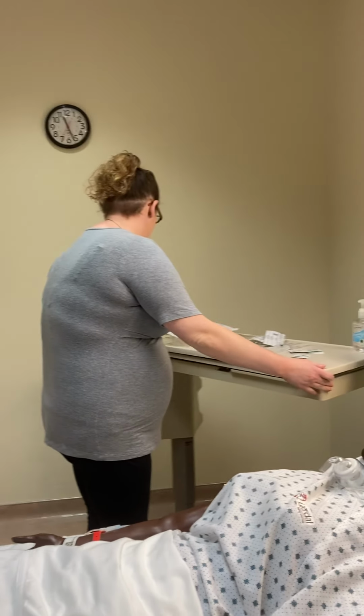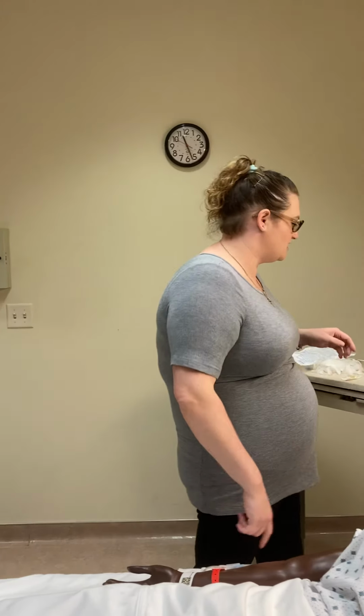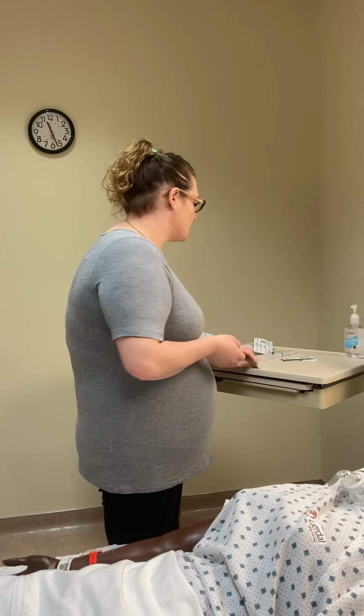Then we have to check our IV patency. So I'm going to go ahead and check patency, and then what I'm going to do is get some fluids running to kind of keep the vein open. So we call it KVO, which stands for keep vein open, and we run the fluid at about 30 mLs per hour when we program it on the pump, okay?